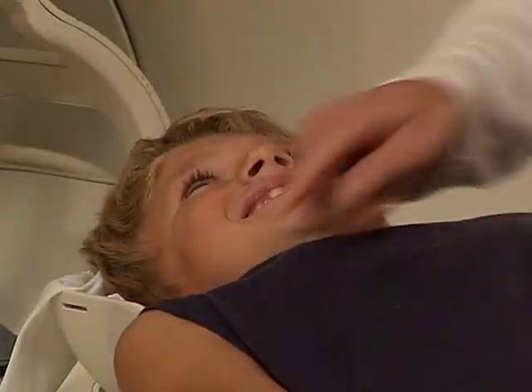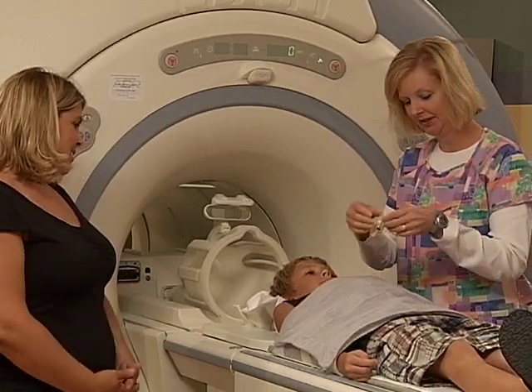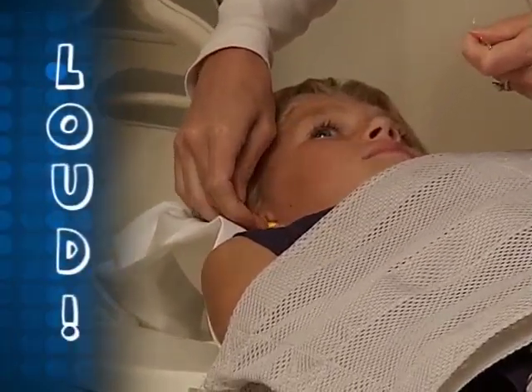The bed will move so you can travel through the tunnel when it's time to take your pictures. Your family member will be in the room with you the entire time, and you can even talk to them before your pictures are taken. Once you're comfortable, you'll be given a set of earplugs to wear, because the camera makes a loud sound when it takes pictures.